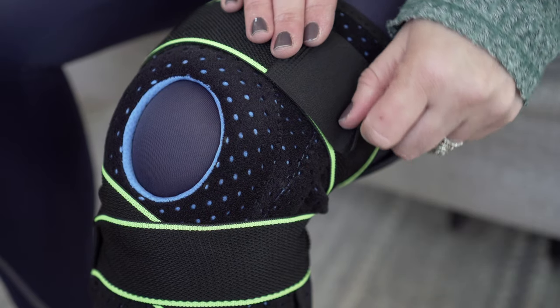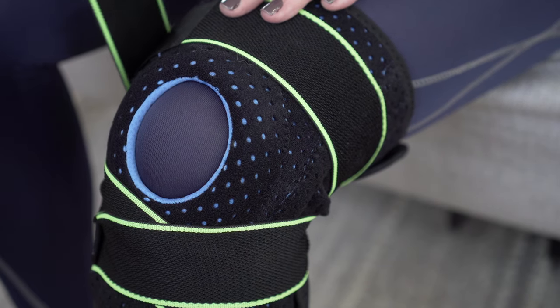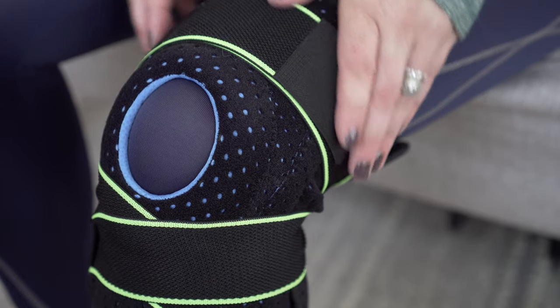Another key feature are the velcro straps that are above and below the knee, and there are also two straps that wrap around your knee as well. These are important because they are going to help you customize the perfect fit and allow you to also customize your compression.